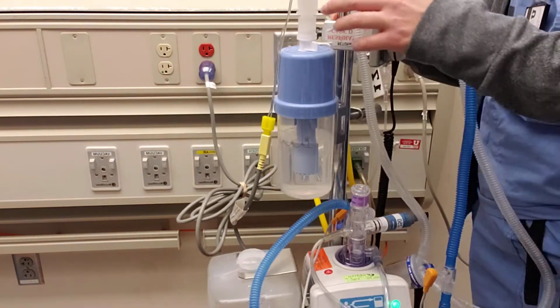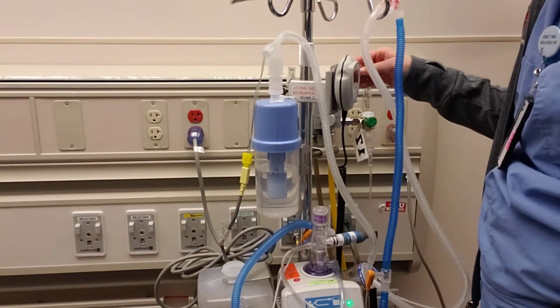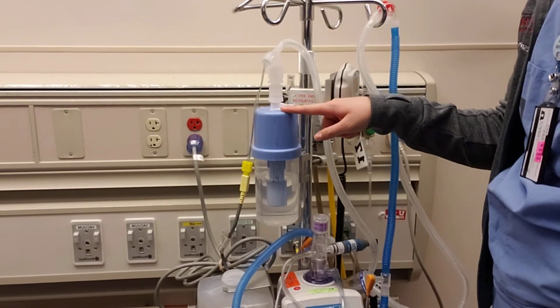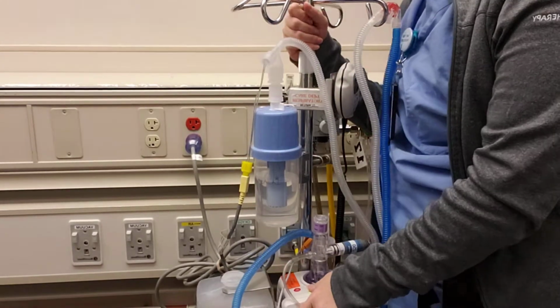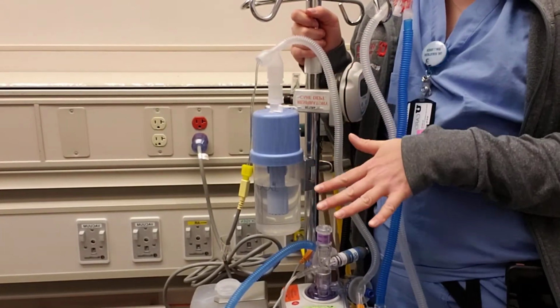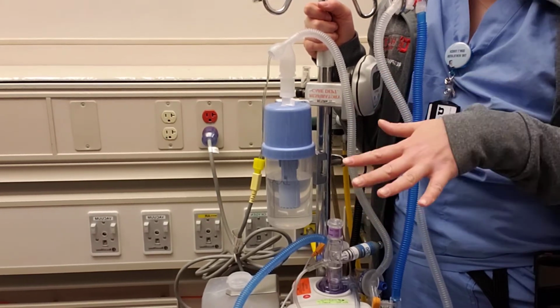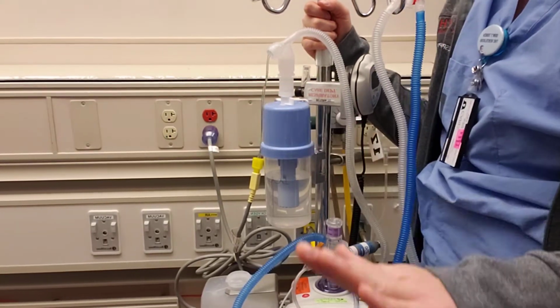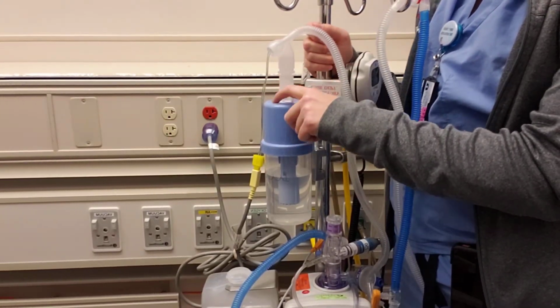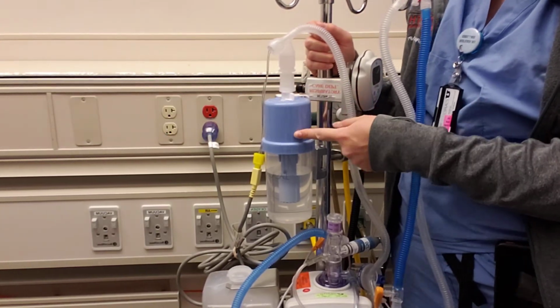So we have our expiratory line. And then we have a dial here. Now watch as I change this dial. It goes anywhere from 1 to 9. Anything below 5 is not therapeutic. 5 is the base you go. Remember, I will roundhouse kick you in the head if anything is below 5 centimeters water pressure. Babies, big people, anything. So typically you'll use anywhere between 5 and 9 centimeters of water pressure.